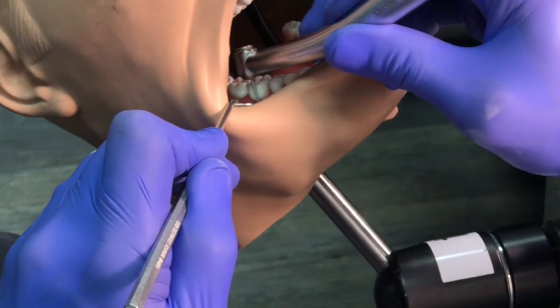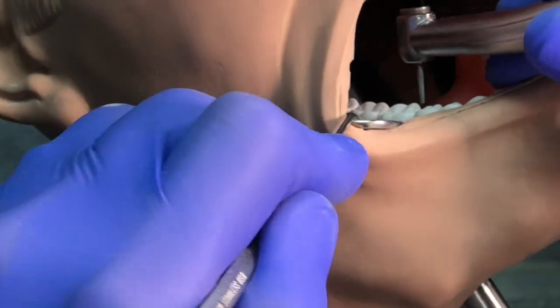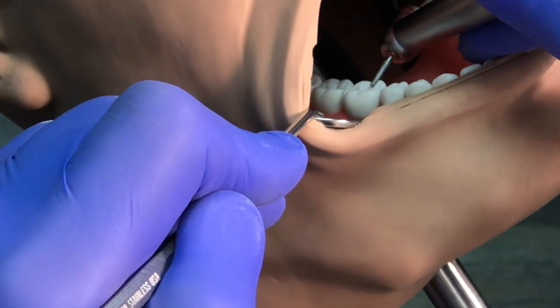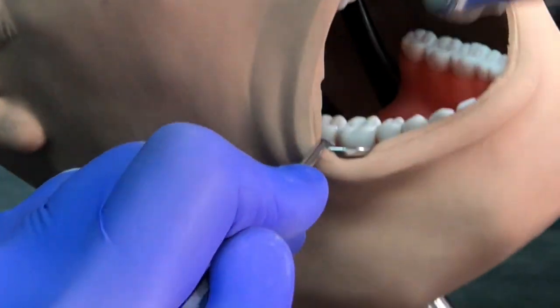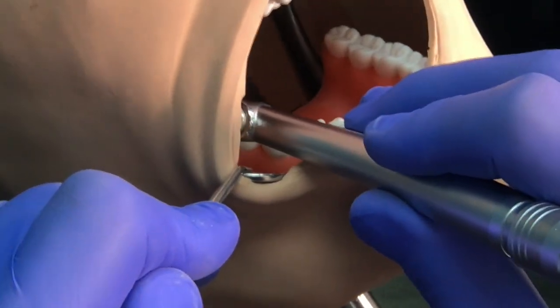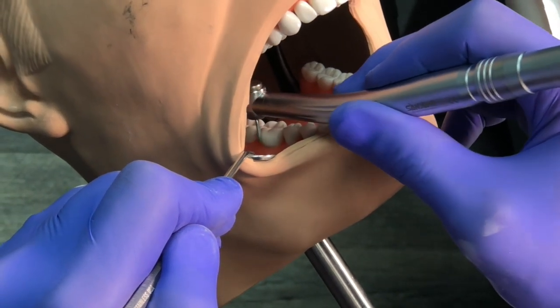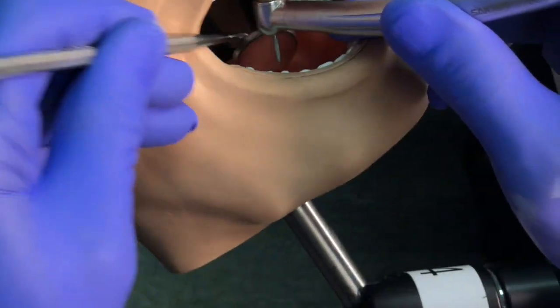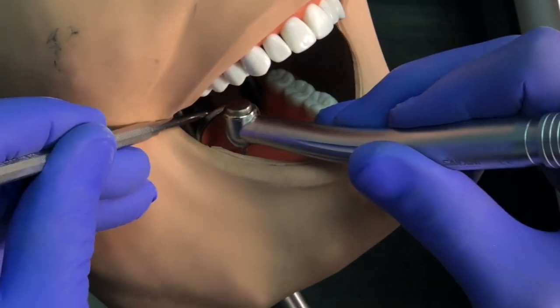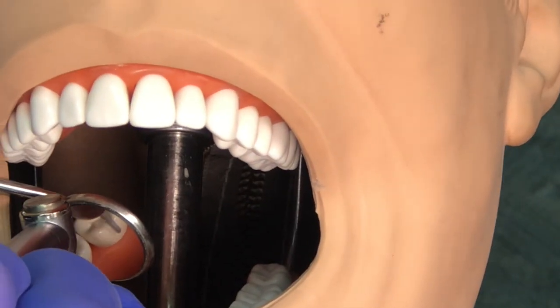At seven o'clock I can align the bur with the long axis of the tooth. The curve of Wilson tilts the teeth toward the lingual — toward the midline. I can do my C-plane reductions, A-plane reduction, flip the handpiece for B-plane reductions with a finger rest on the anterior teeth. I can establish buccal reduction and lingual reduction. For the lingual reduction, I put the mirror across the back of the teeth to retract tissue and look in the mirror.